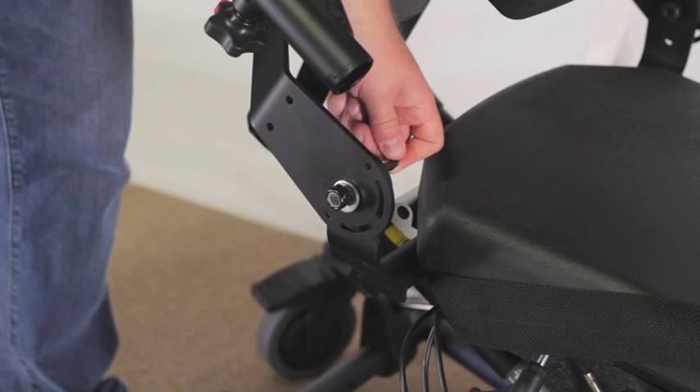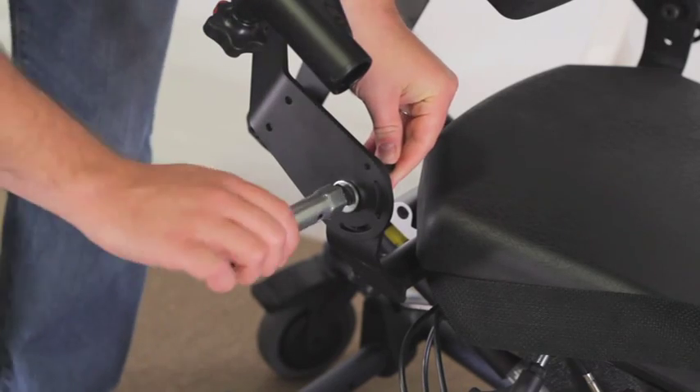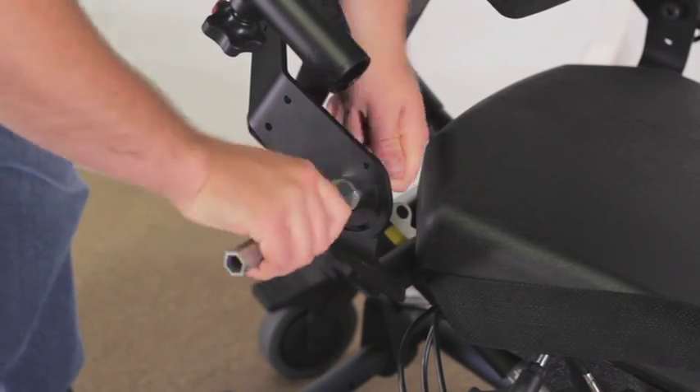Using an allen wrench and the wrench from the tool kit, tighten the bolt and lock nut snug. Do not over tighten. Repeat the steps for the other side of the unit.